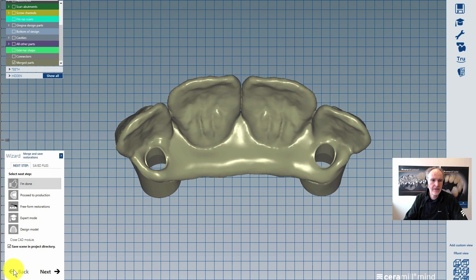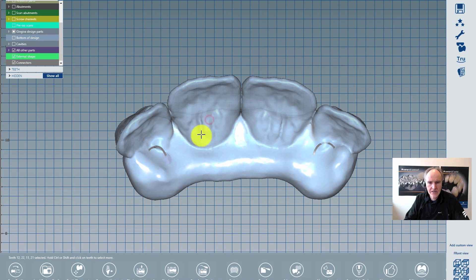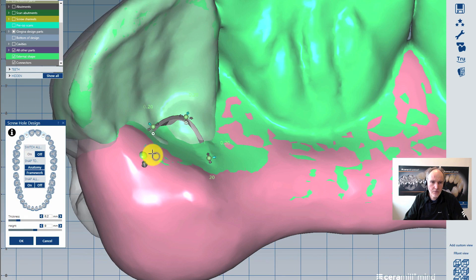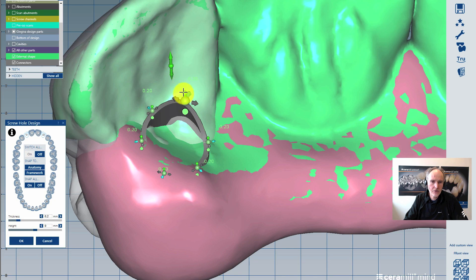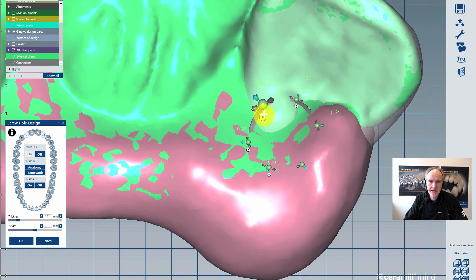If necessary, I could create screw channels here on the toolbar. I'll leave it like it is and click OK.